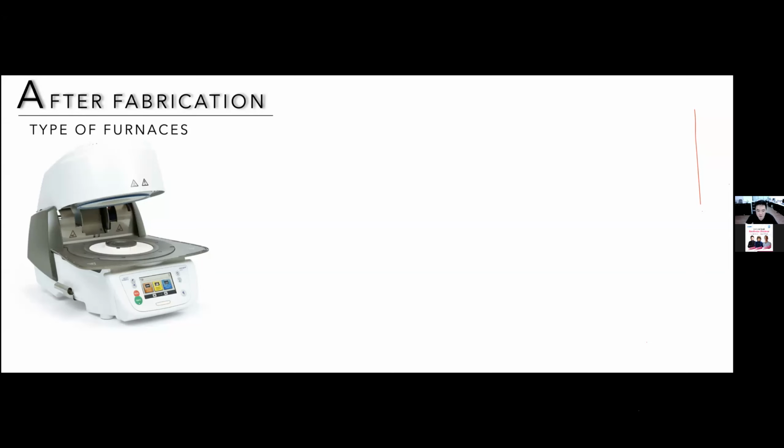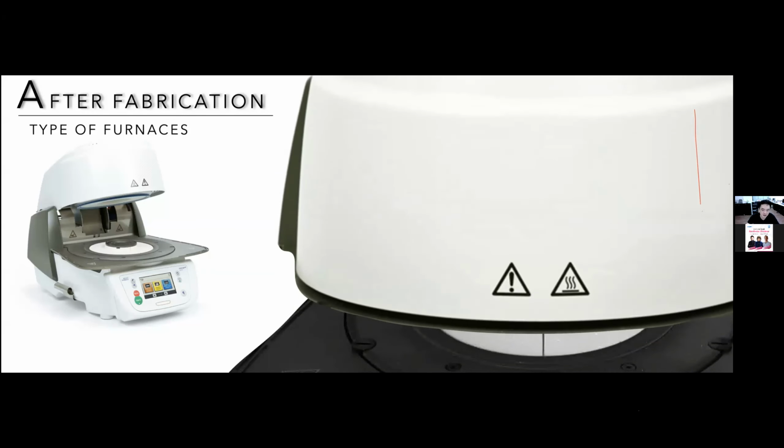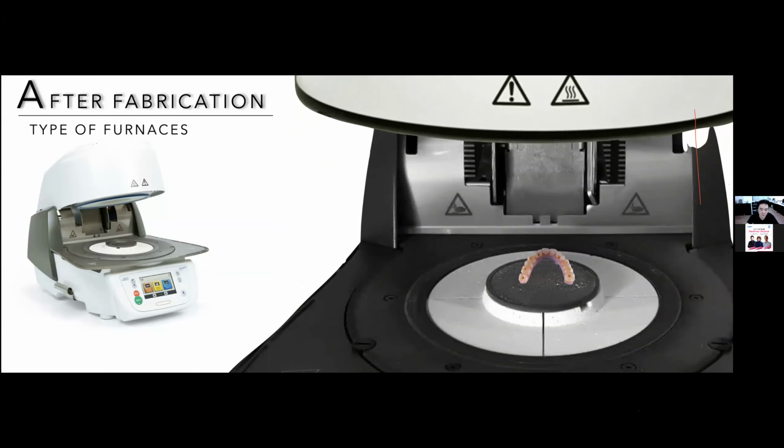So when you want to use this type of furnace to bake your big restoration or a long span, please follow this step and this position.